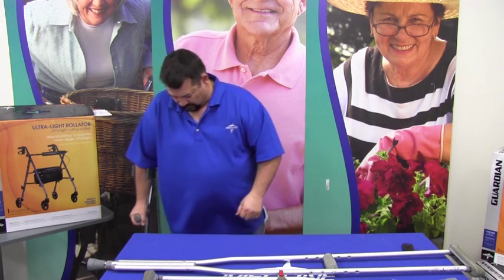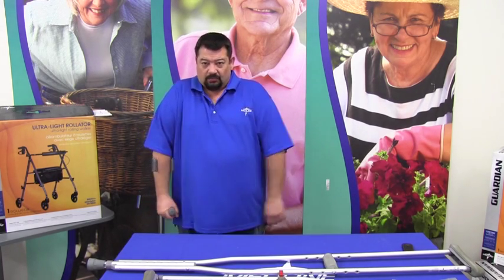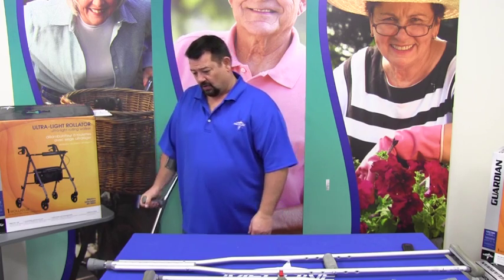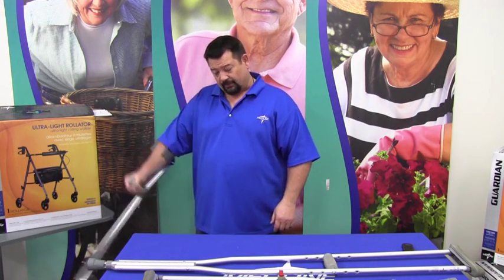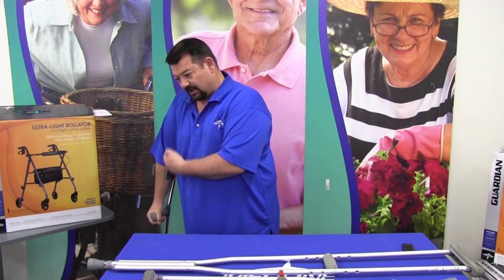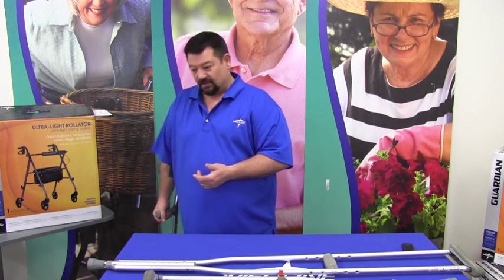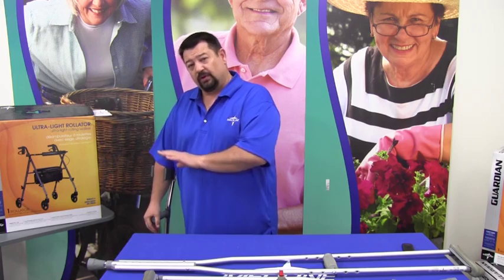But the crutch itself, because of the way that the arms hang off the body, arms don't necessarily hang straight down evenly. They're going to be slightly canted out. And that's exactly how this crutch is used. So when you have this crutch being deployed, the firm connection points are all solid, the heights are measured, and then any detail adjustments that the patient may want, they may have developed a tendency to have the crutches out a little farther, in a little narrower, but at this point you've got basic structure.